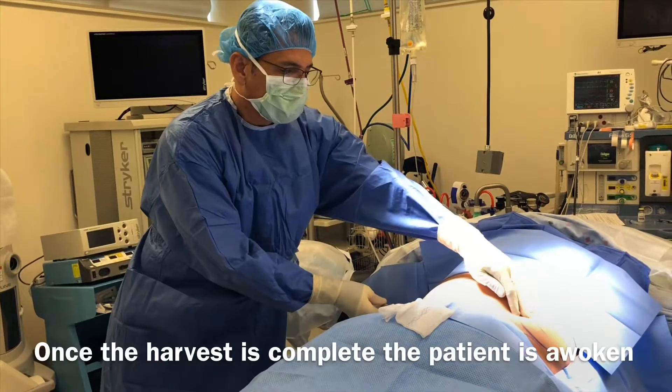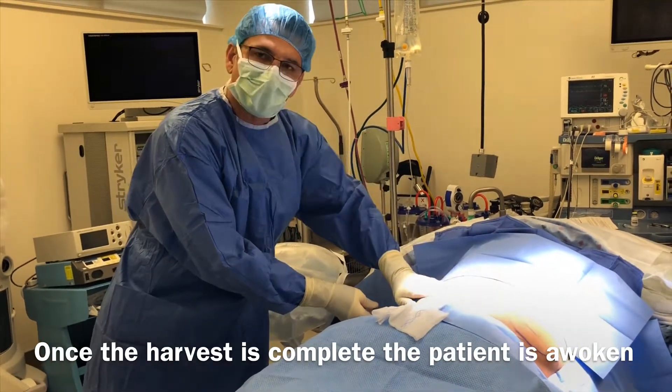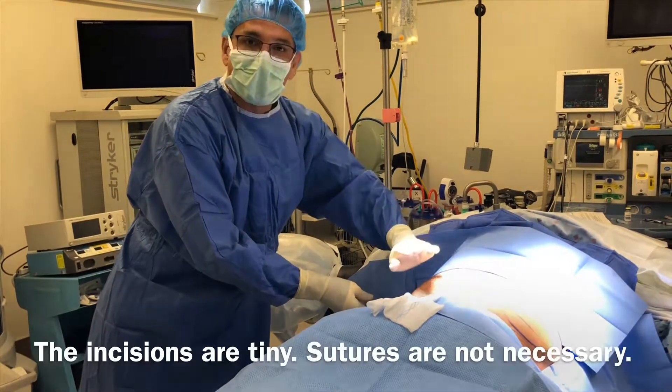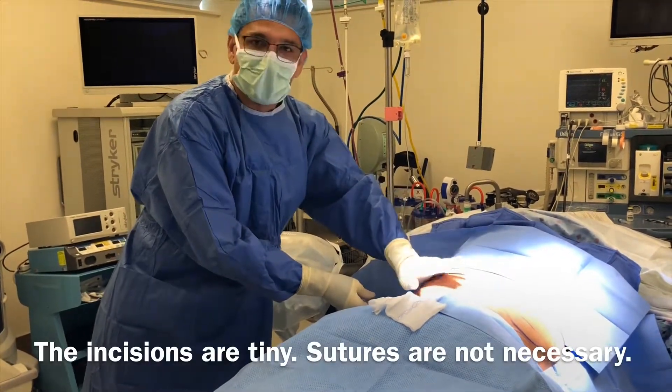I collected about 40cc from that side and I'm going to collect about 40cc from this side. That way we remove a symmetrical amount of fat so that there's no issues with the belly afterwards.